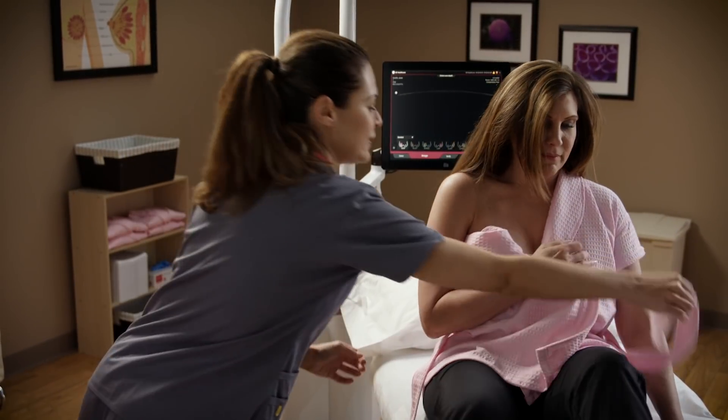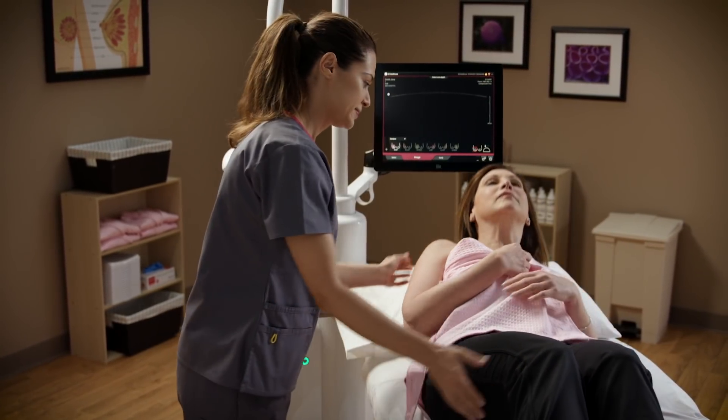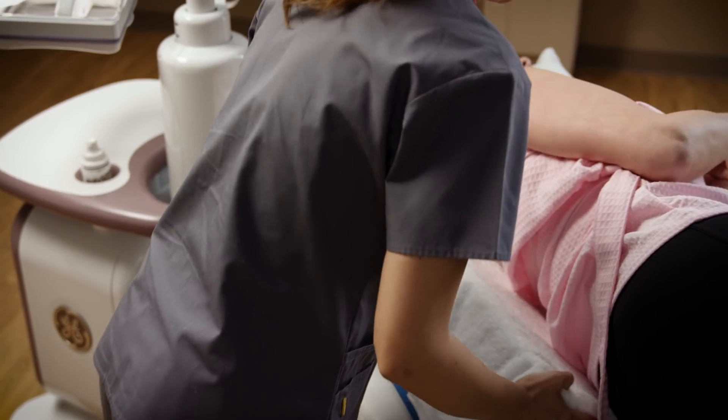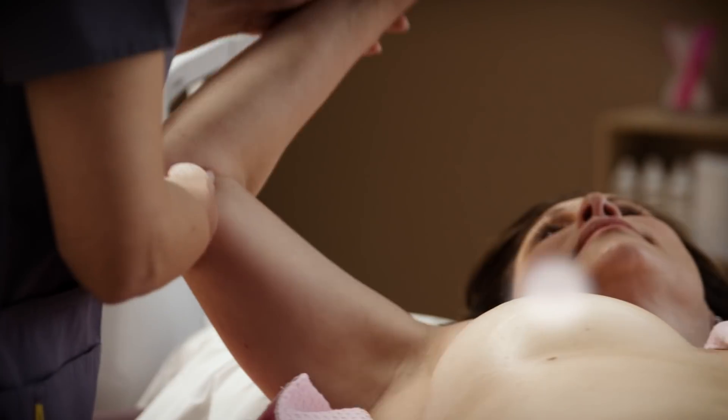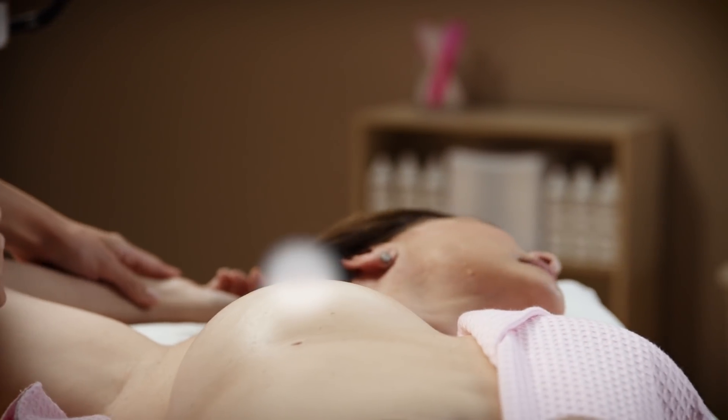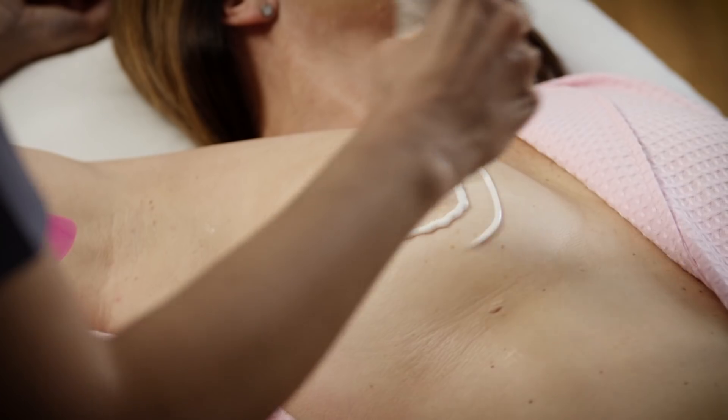Proper positioning is necessary to help achieve high quality studies. The patient lays supine. Towels, sponges, or pillows may be used to help evenly distribute the breast tissue and position the nipple pointing toward the ceiling. A thin layer of ultrasound lotion is applied.